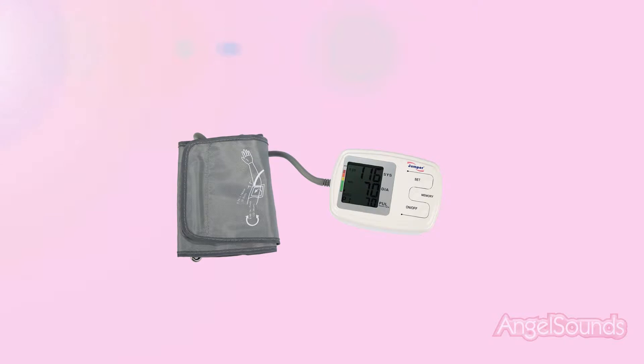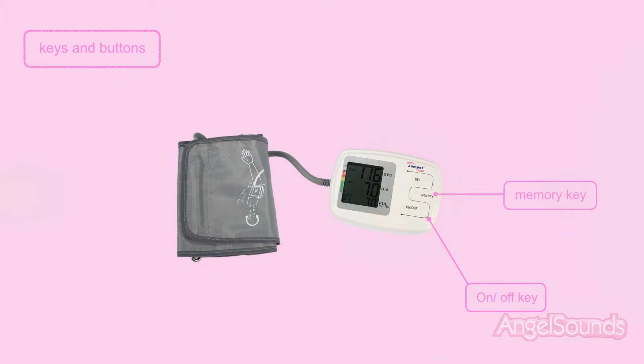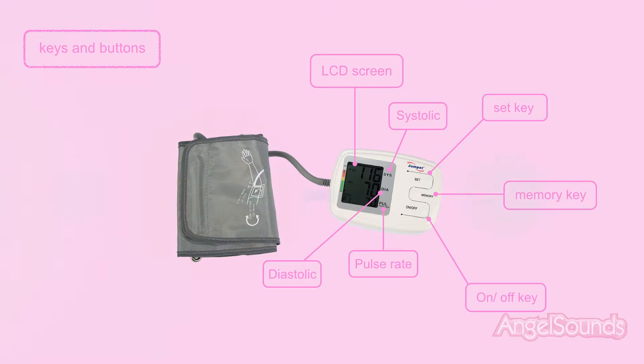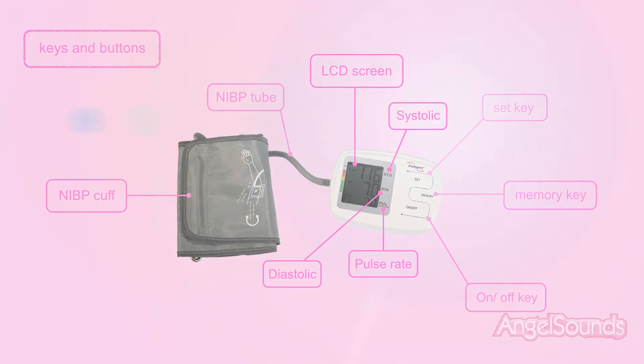Keys and buttons: on-off key, memory key, set key. LCD screen displays systolic, diastolic, and pulse rate. NIBP cuff and NIBP tube are also shown.